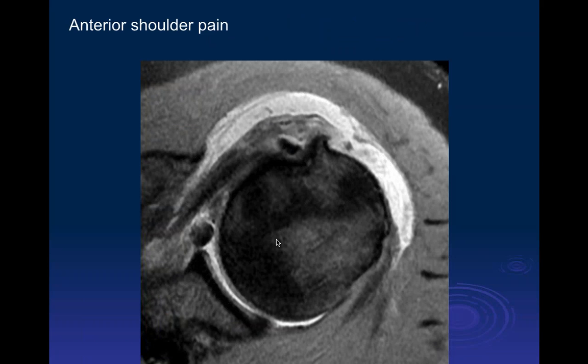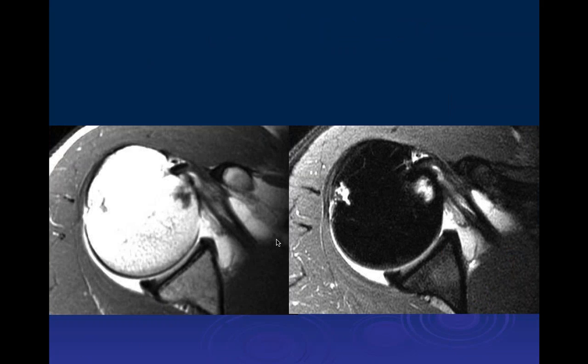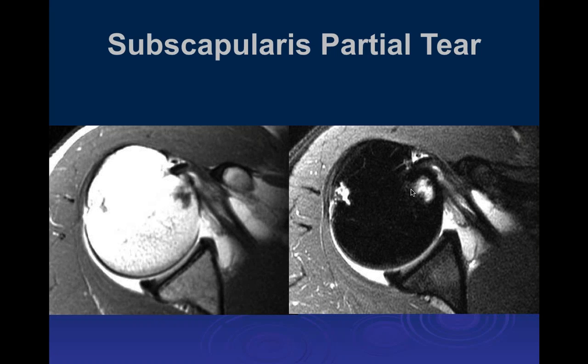The anterior labrum is also abnormal here. On another arthrogram with axial images, there is longitudinal signal within the subscapularis tendon compatible with an interstitial tear, plus erosive changes of the subscapularis and possibly the infraspinatus on the other side.